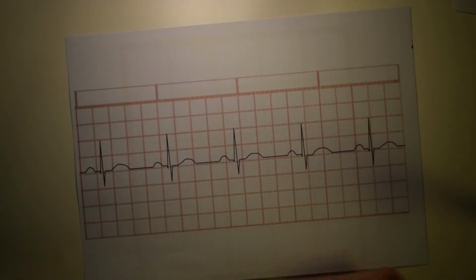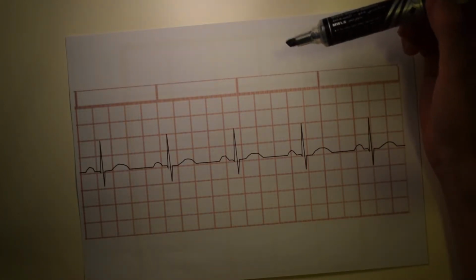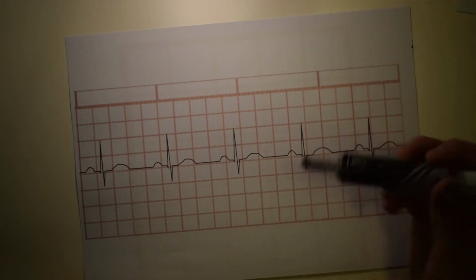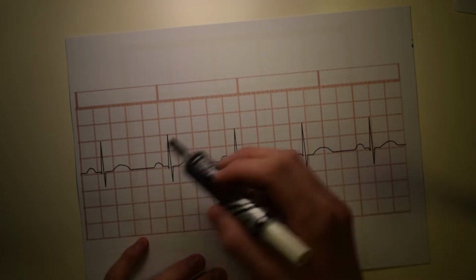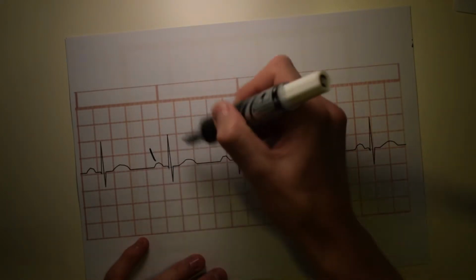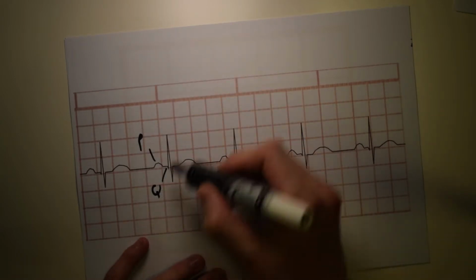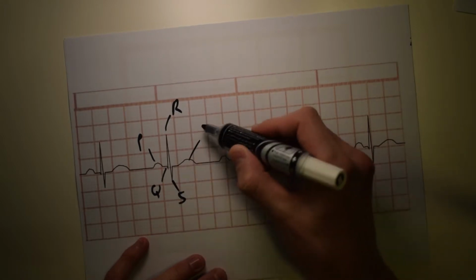Right, so what you see here is the typical ECG. You'll see a whole bunch of lines, a whole bunch of ups and downs. What we're going to try and do is explain what each little line means. The first little bump we see is called a P wave. Then we have a Q wave, an R wave, S wave, and a T wave.